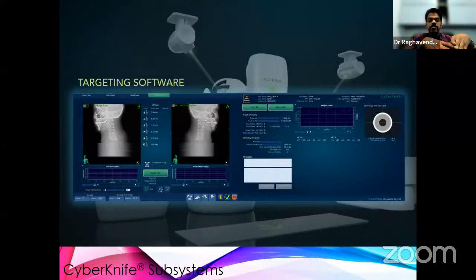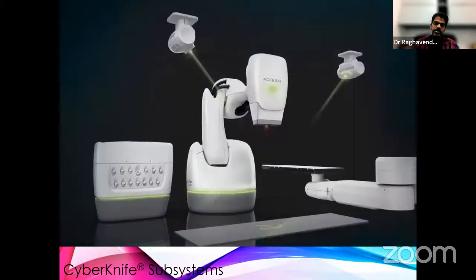They basically run with targeting software where, based on the site, like brain, a spine case, a fiducial-based prostate or a lung, you need to select the protocol first, and based on that protocol the targeting software gets activated. The machine has a floor-mounted detector and ceiling-mounted X-rays. These constantly take images, irrespective of the linear accelerator position. That is the difference between a LINAC and a CyberKnife.